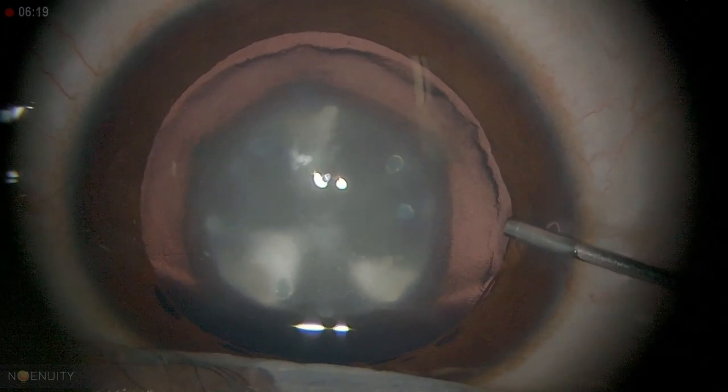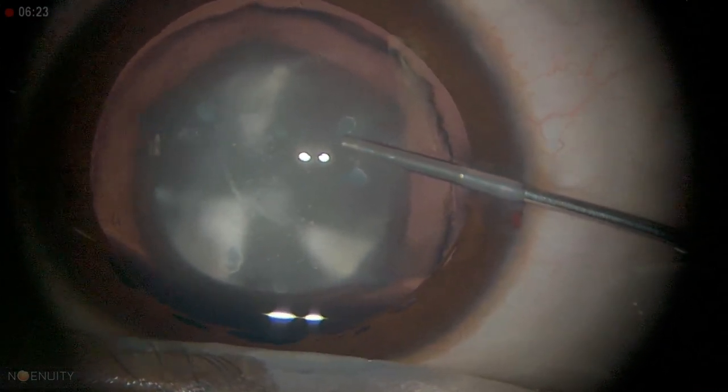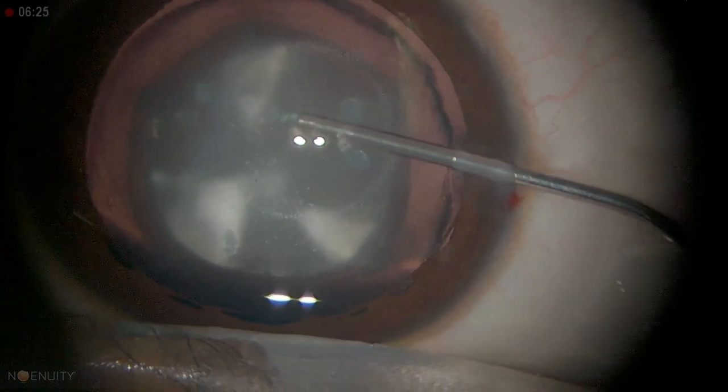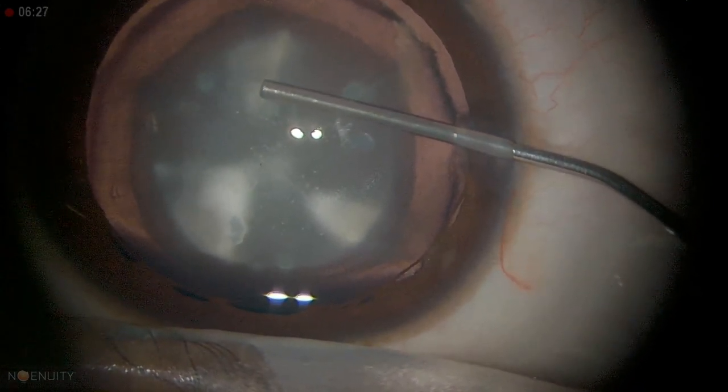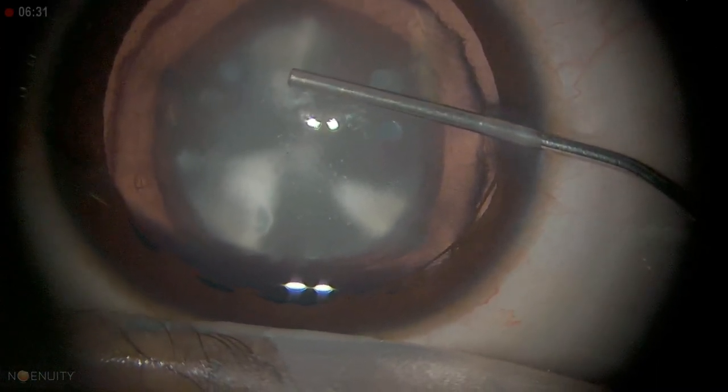I'm injecting the viscoelastic — I'm using ProVisc here. You can see it deepens the anterior chamber and at the same time it can mechanically dilate the pupil a little bit more.